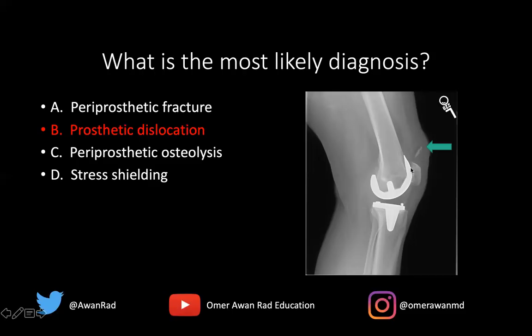Also, the space between the patella and the femoral component of the arthroplasty is not optimal. The patella is actually abutting the metal, which is a clue that something is wrong here. So this is a nice case of a prosthetic dislocation.